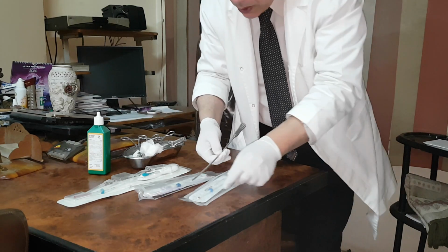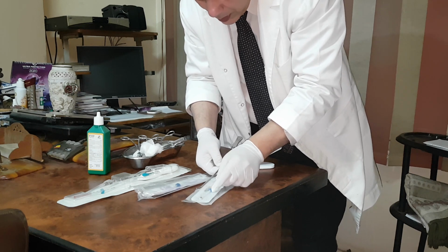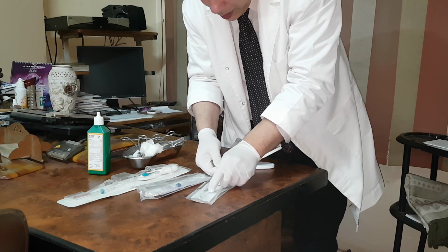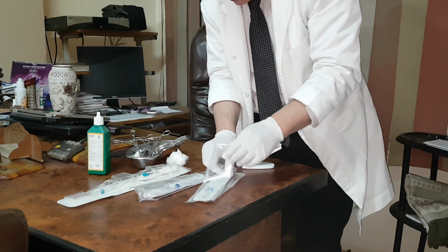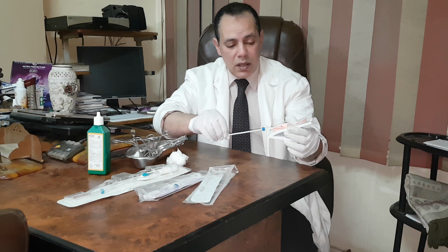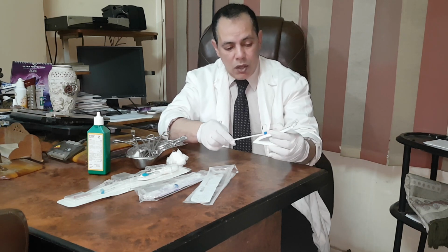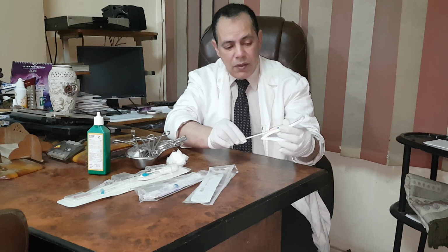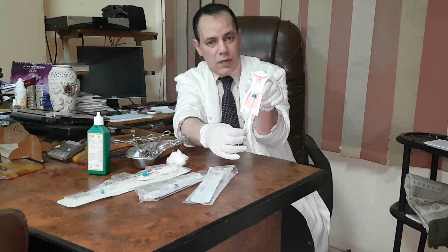Suppose it is 5 centimeters. I have here a scale. I can measure, yes, this flange, I measure it like this, so the flange is okay. So I'm going to insert the IUD using the withdrawal technique. How can I insert? First resistance will meet me, the internal os, second resistance will meet me, the fundus.